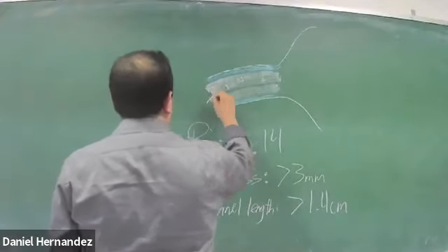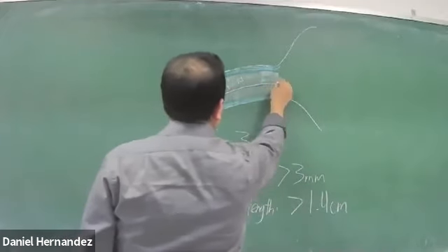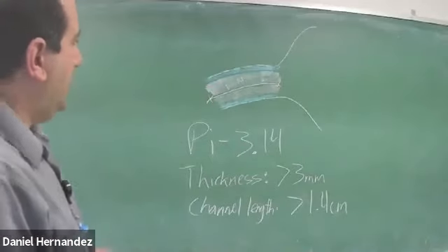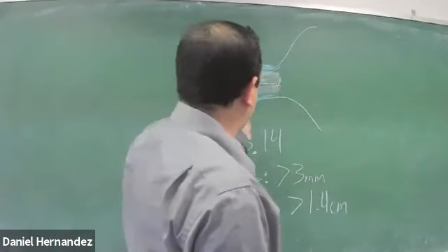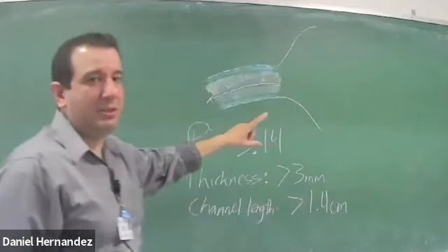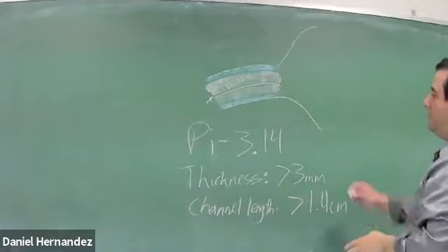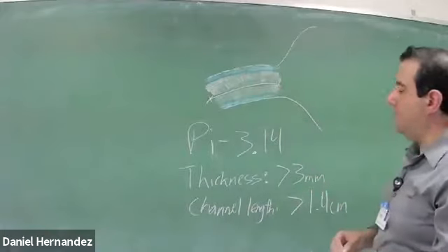So your length for your calipers, measure across that channel length. And remember, as this muscle gets thickened, the weight of it is going to actually typically pull it down. So that's another thing too. Oftentimes with a positive pyloric stenosis, you're going to wind up with that pyloric muscle posterior to that distal antrum. So it's going to kind of bend down. So it's not going to be a straight line across.